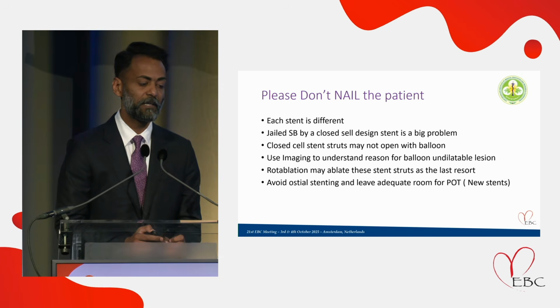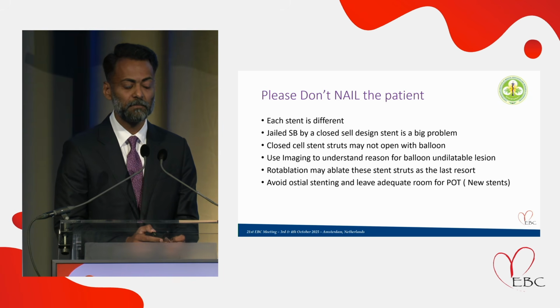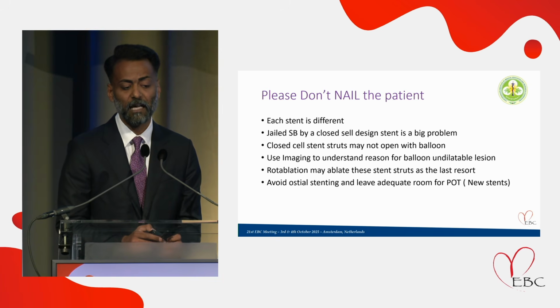Each stent is different. A jailed side branch by a closed cell design stent is a big problem. Closed cell stent struts are not designed to open with a balloon. Use imaging to understand the reason for a balloon undilatable lesion. Rotablation may ablate these stent struts as the last resort, but should be done with extreme caution.